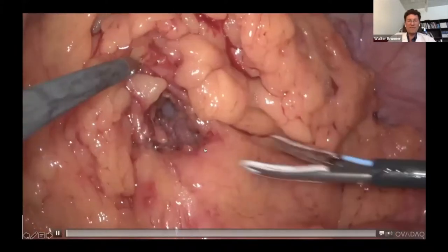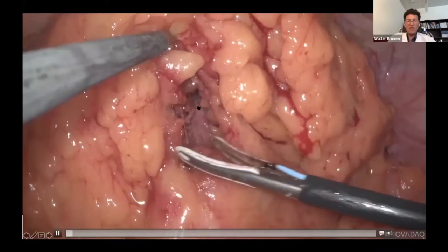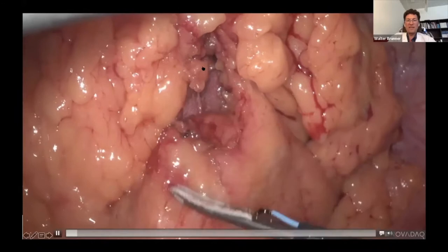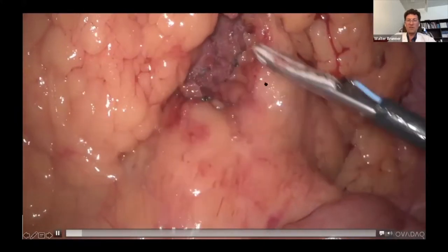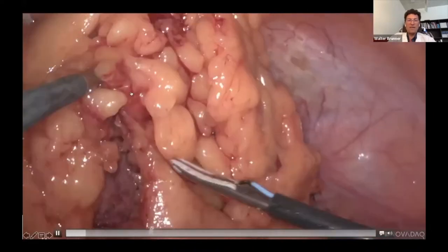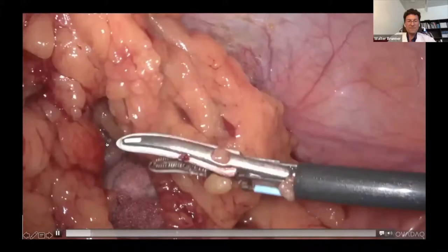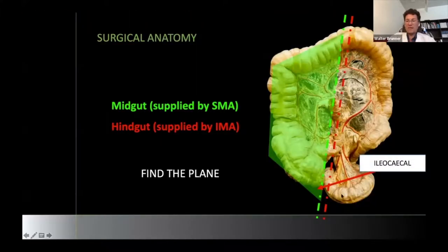We go up. This is the border of the peritoneum — you can grab it here, but not inside. Just grab the border of the peritoneum. This is porous, but if you lift it any other way you will rupture it. Here is the vena cava, here is the aorta, we go up to Treitz's flexure. You see the duodenum — as long as you see it, it's perfect. You have to anticipate it's here; you don't want to damage it. I put the swab to lift up the meso. This is the right mesocolon, this is the duodenum. I don't grab the meso — I put the swab and lift up the whole specimen to avoid breaking into the meso.